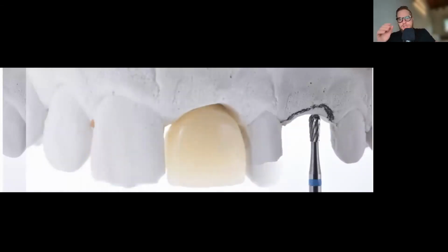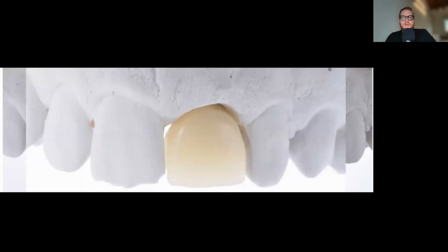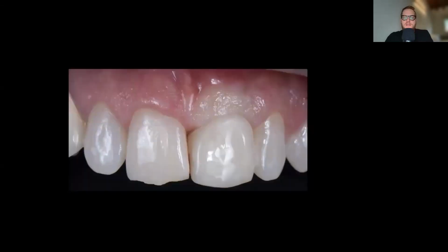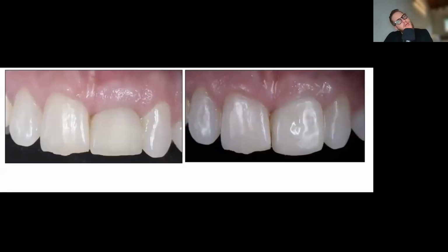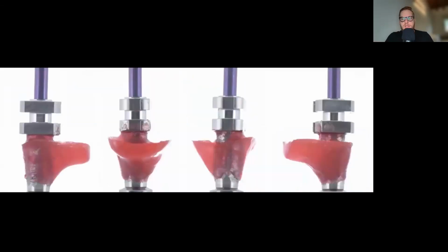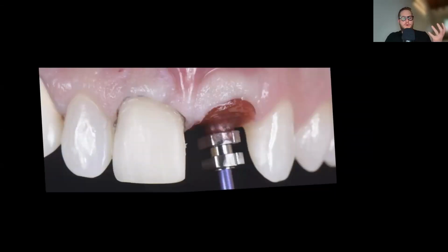And we work on pushing the tissue by adding material. So as you can see where we were and all the material that we added, this is more or less what you want to see in these cases. We put it in the patient's mouth and we start working on grooming that soft tissue. And every time we push a little bit more until we're happy. Once we're happy, we're going to use this technique to duplicate the provisional and the subgingival contours. That way we can create this personalized impression coping and support the tissue.